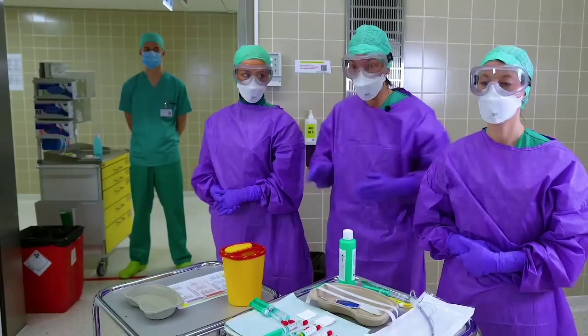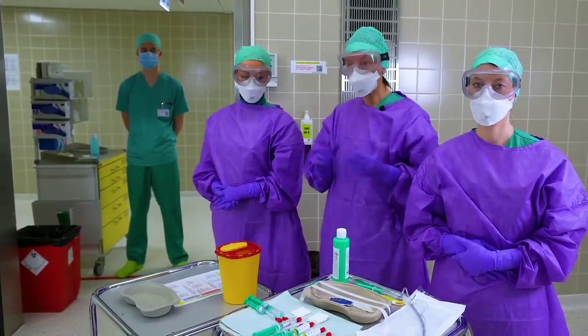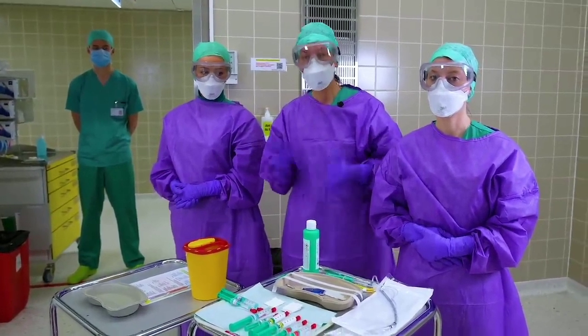Our concept is divided in three phases: the planning phase, intubation and extubation, as well as post-operative care. All these phases are equally important.